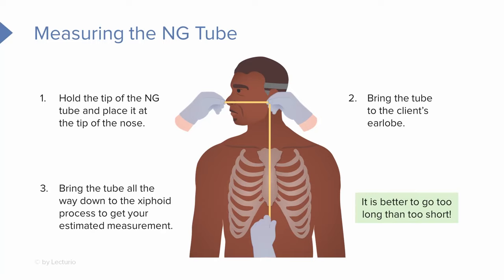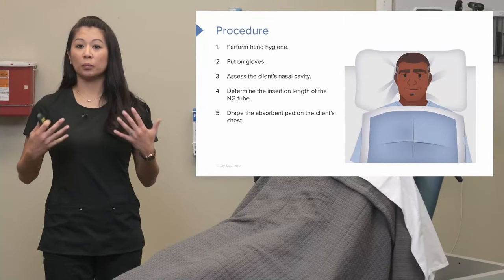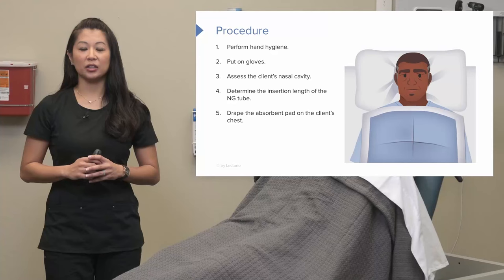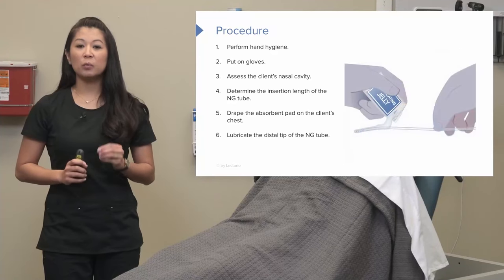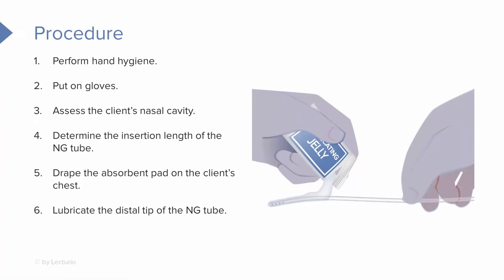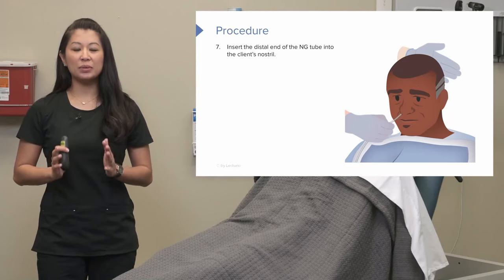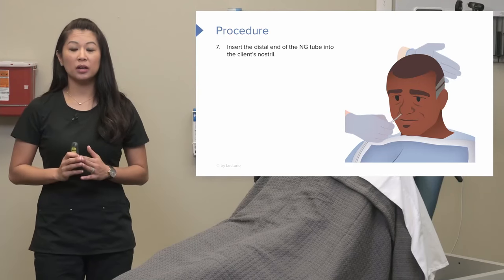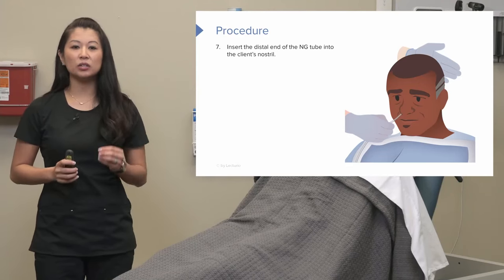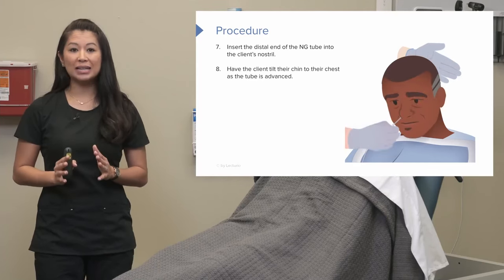It's really better to go a little long than to be short. After we've done this, we can drape an absorbent pad or a towel over the client's chest. Then we want to make sure we lubricate the tip of the nasogastric tube — this is really key to help with insertion and make it much smoother and more comfortable for your patient. Once we've lubricated the tip, have the client position their head straight forward.